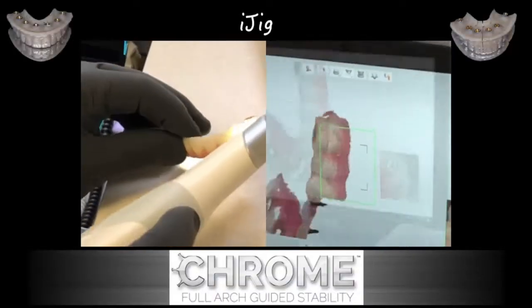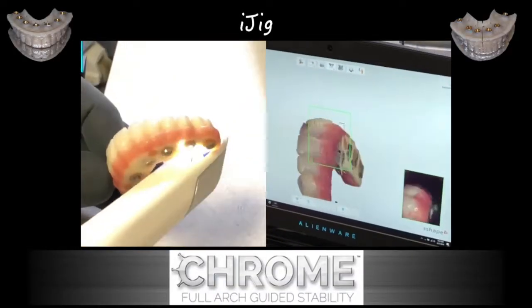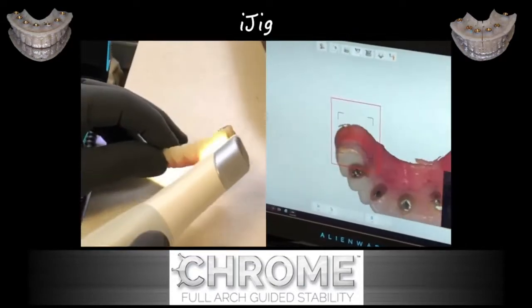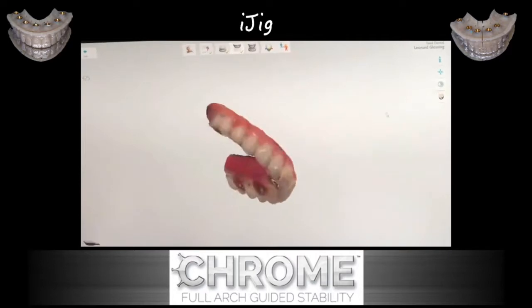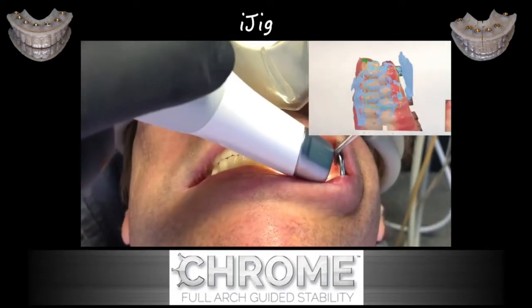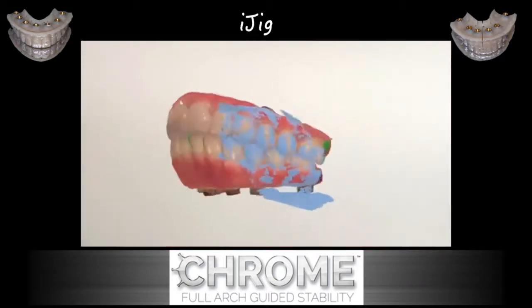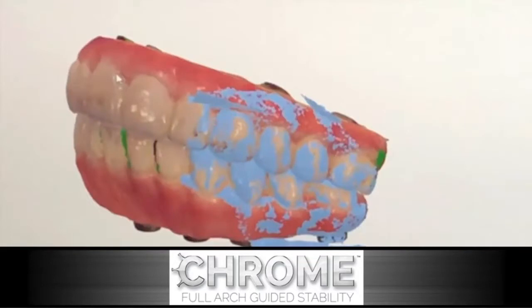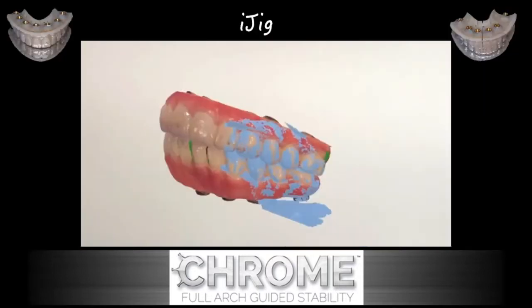The iJIG concept is the ability to take the prosthesis — that is, the temporary prosthesis — and instead of going through the normal protocols and steps we've learned in the past, we can either do an intraoral optical scan and record the bite, we can take impressions, or we can use a desktop scanner and record the position of the existing prosthesis. This temporary prosthesis is what we're going to convert to a final prosthesis.